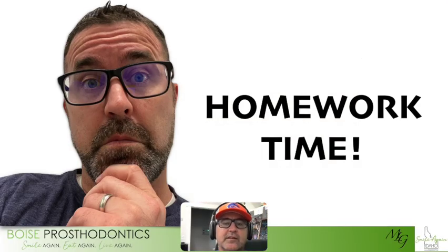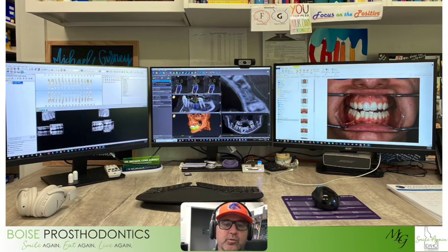Like I said, once that data is gathered, I will send the patient home and I'll get to do my homework. Yes, school is over, but when you get to these complex cases, homework is so important. Here is my homework workstation. I've actually added a monitor to help make this process more efficient, but usually I'll sit down with all the data in front of me and be able to analyze it and work through my process to help identify what are the best solutions. So I'll just show you that process.